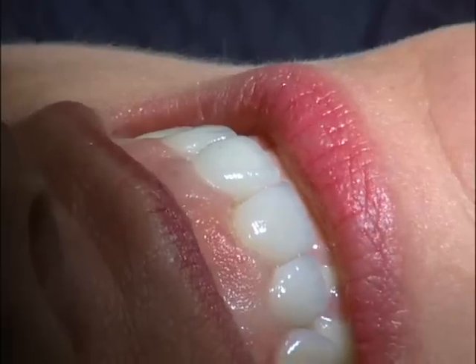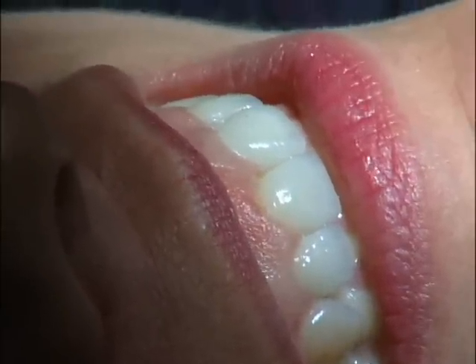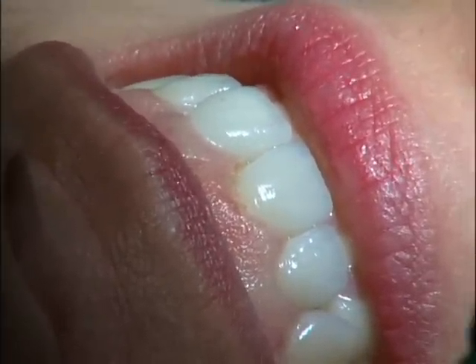We want water on the surface of the tooth — 3.3 — and it's protecting the tooth with the water. 3.3 and 50 hertz. Remember, by lowering the hertz to 50 hertz, more comfort for the patient.